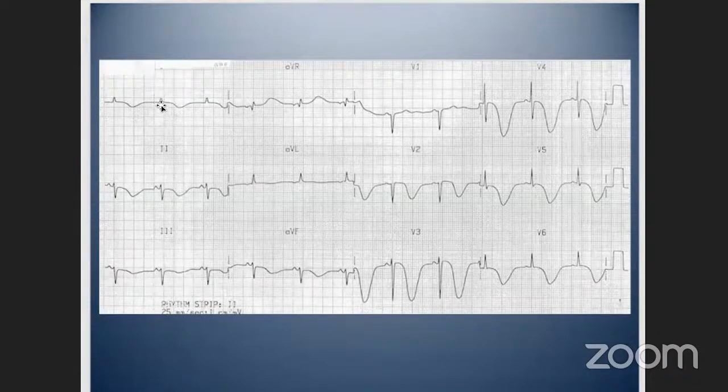So I would have my thumb up on my left-hand side in lead 1. I would have my thumb down in AVF. And so that is a left axis deviation pattern. But it does seem regular. My intervals do seem normal. Perhaps my QT is quite prolonged.